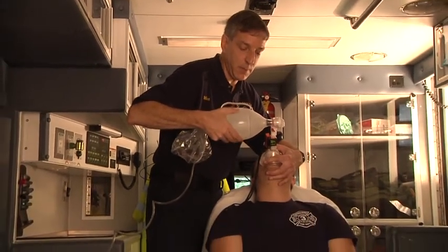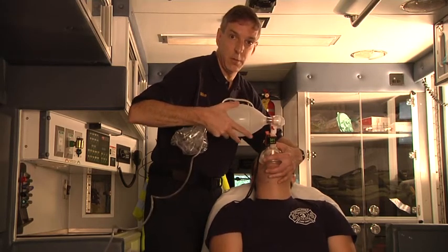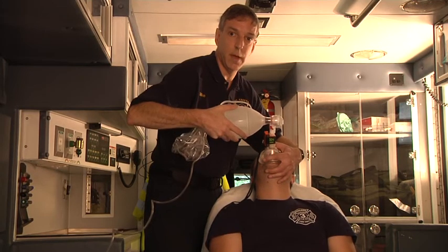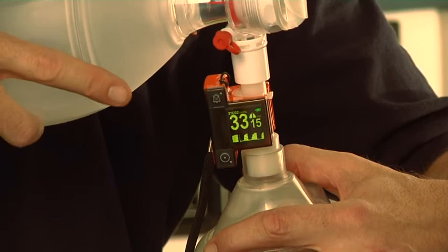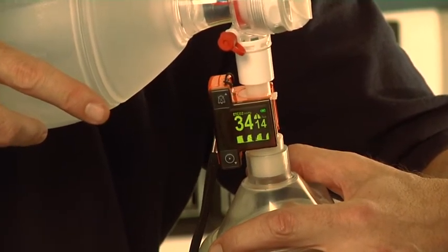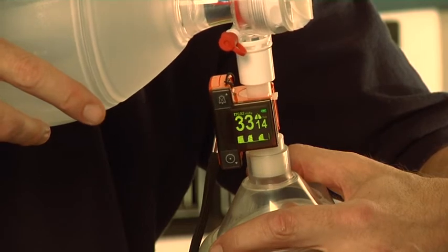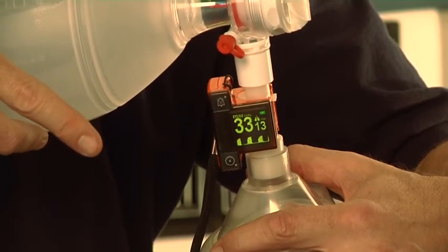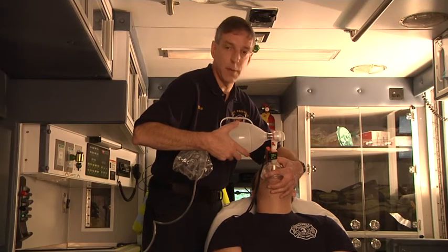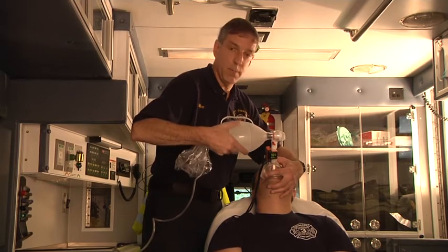If a patient was completely apneic, you could ventilate them at the rate you see fit for that patient in order to maintain an exhaled carbon dioxide of somewhere between 35 and 45 millimeters. Using a device like this allows you to not only see the rate at which the patient's breathing, but also to time your ventilation and choose a rate that gives sufficient respiratory effort, measured by exhaled carbon dioxide. Keeping that exhaled carbon dioxide between 35 and 45 will allow you to pick the ideal rate for the patient.